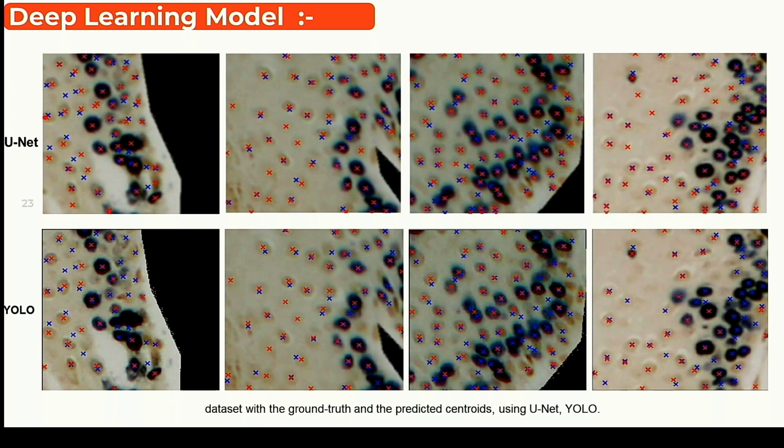We can see here that it doesn't matter whether the ground truth is annotated by the expert at the centroid or not, because our methods focus on selecting the centroids, and we have a diameter to check any point around this value and make it a point, to avoid overlapping between the cells.